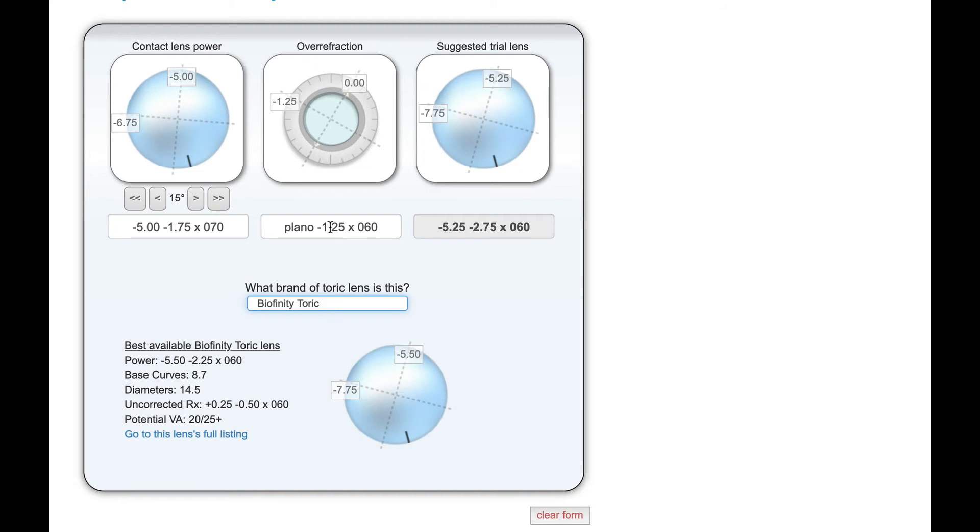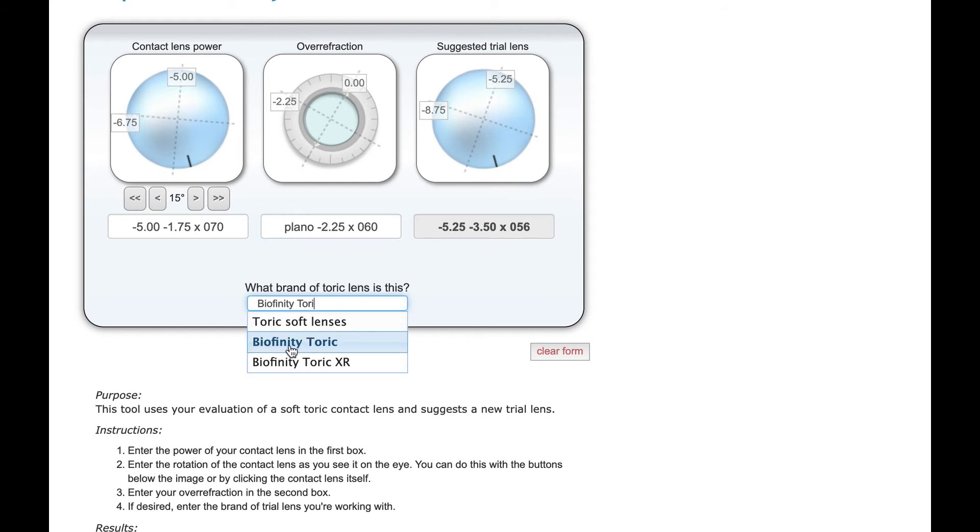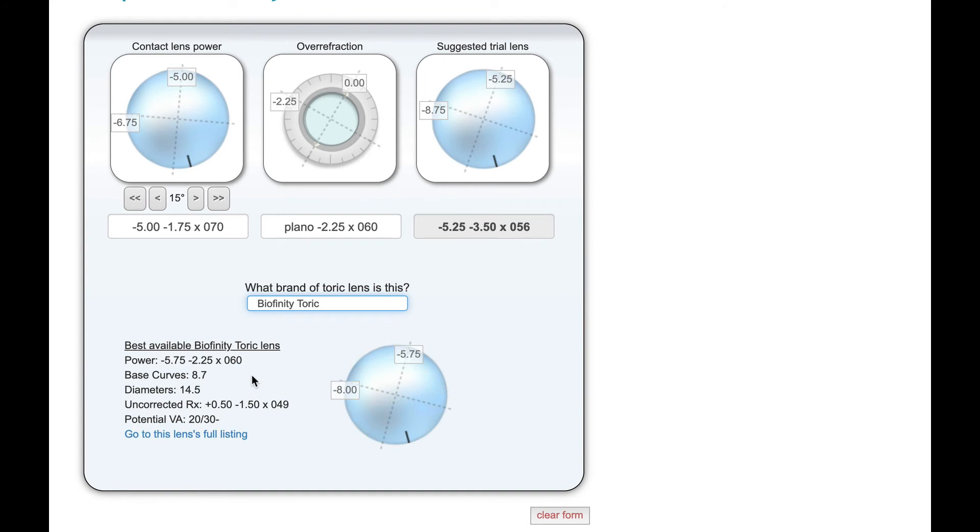If we take that to a bigger extreme, let's just say our refraction came up with two and a quarter. Well, then we're starting to under-correct the cyl by quite a bit more. And it's saying that we'd probably get worse than 20/30 vision. And this gives us a chance to make a decision and say, you know what, this might be just unacceptable for my patient and I might just need to choose a different brand.